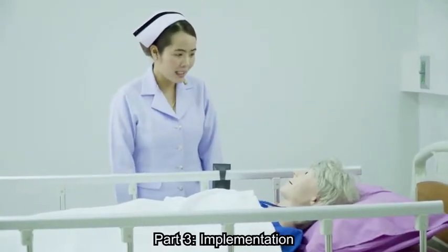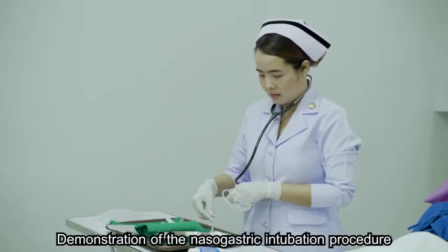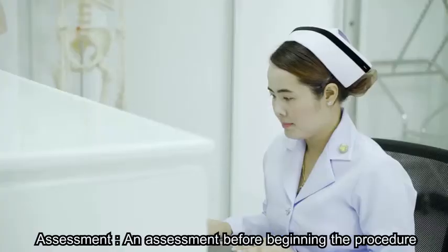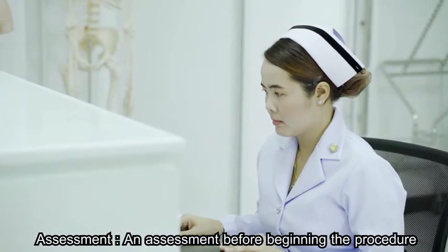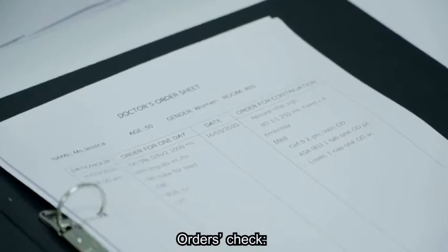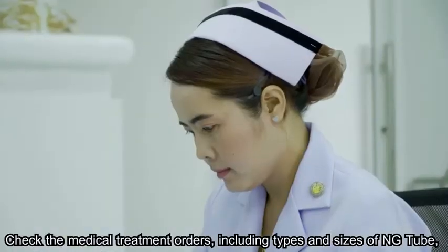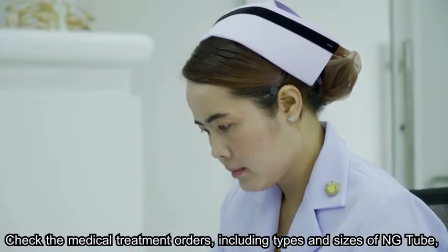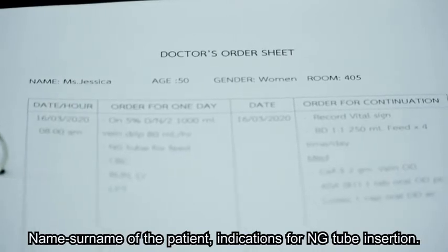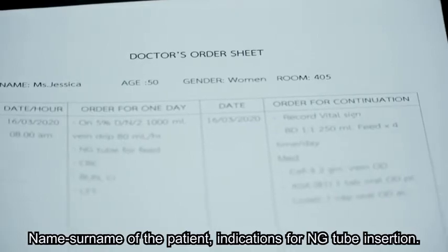Part 3. Implementation. Demonstration of the nasogastric intubation procedure. Assessment: an assessment before beginning the procedure. First, orders check. Check the medical treatment order, including type and size of NG tube, name and surname of the patient, and indication for NG tube insertion.